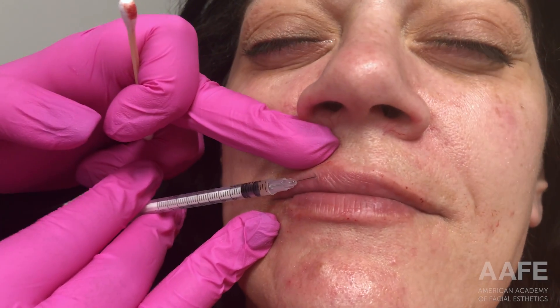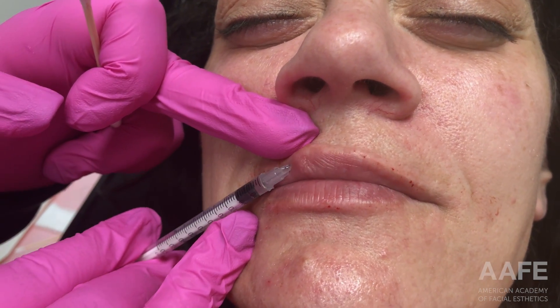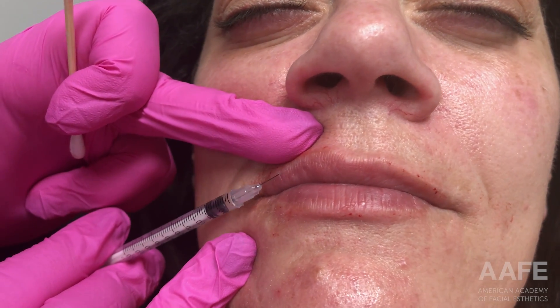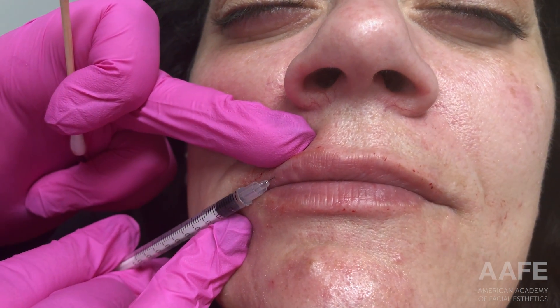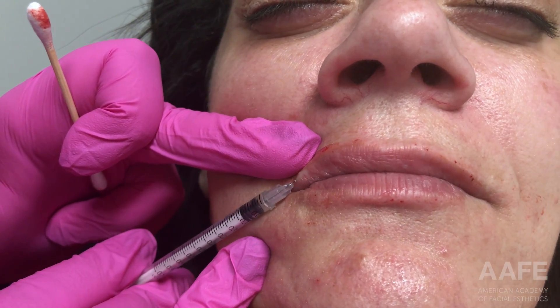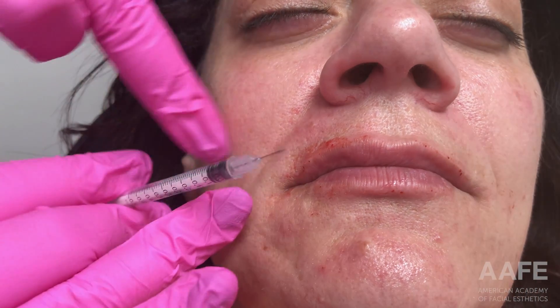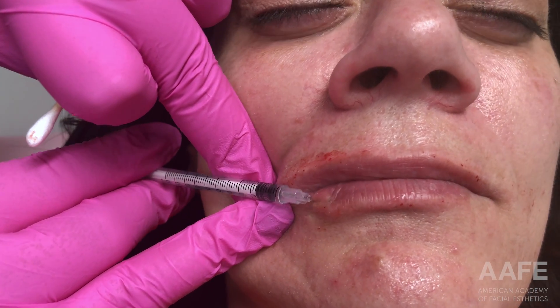Now I have some filler left over that I backfilled into the 0.5 comfort talk syringes, so I'm just using those syringes and doing standard volume. Most of the time you'll see standard volume done with the actual syringe the filler comes in — whether with a 27-gauge or 30-gauge needle — but because I had backfilled most of the product into these comfort talk syringes, I'm just using those to do some standard volume.